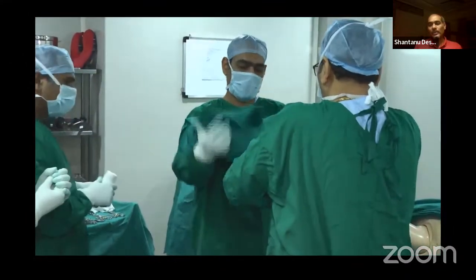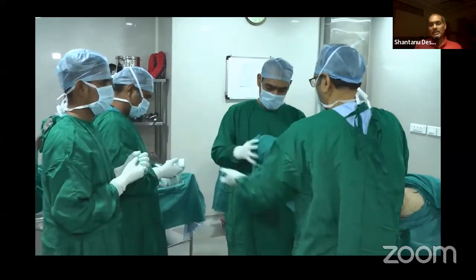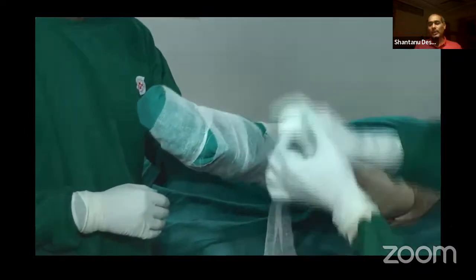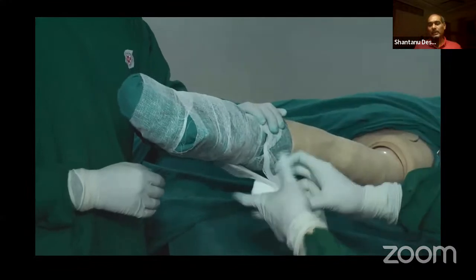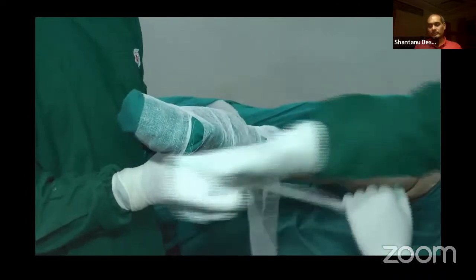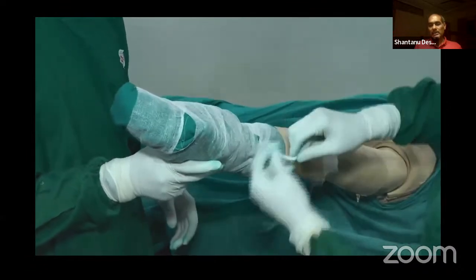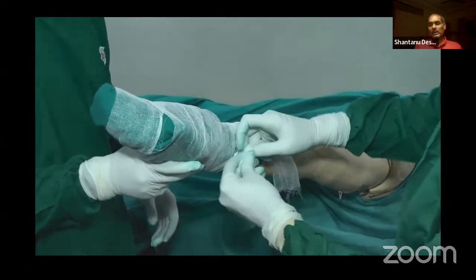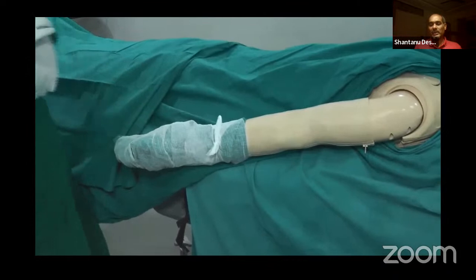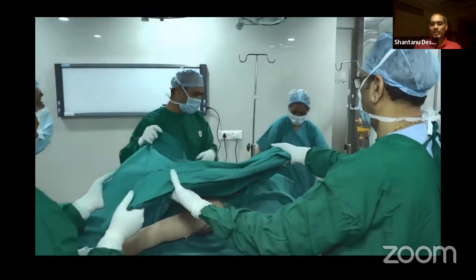the arm and the forearm is covered depending on your extension of the incision. If you want to leave the elbow free, then only use the forearm, wrist and hand in the drape and secure it with the bandage. By doing this, you are making sure that the axilla and the space between the fingers, which are likely to be contaminated areas, are not being exposed.